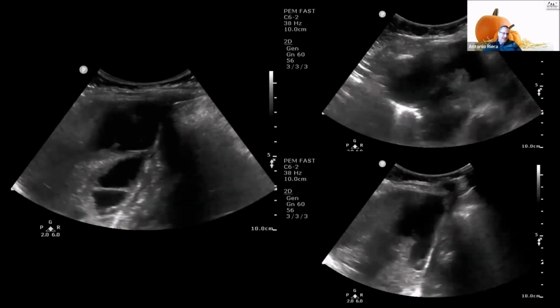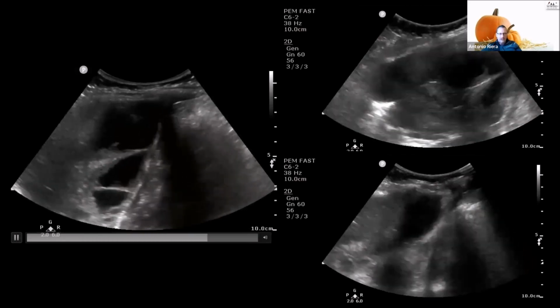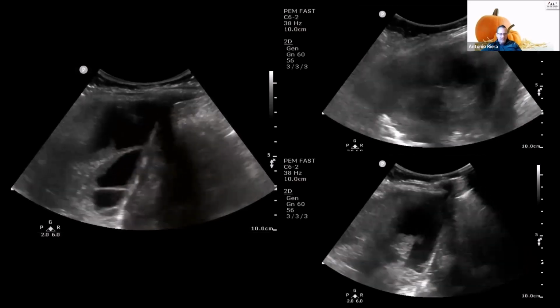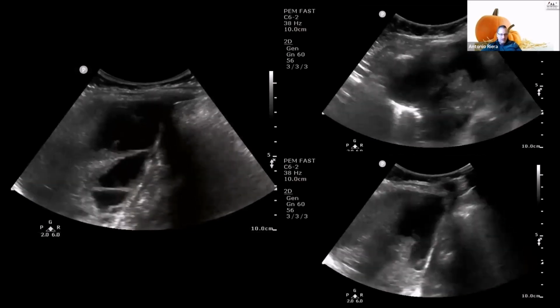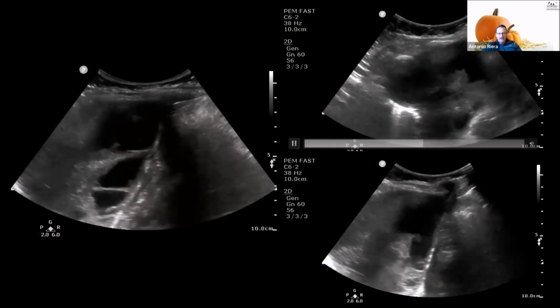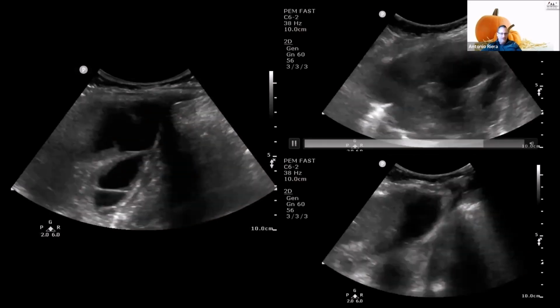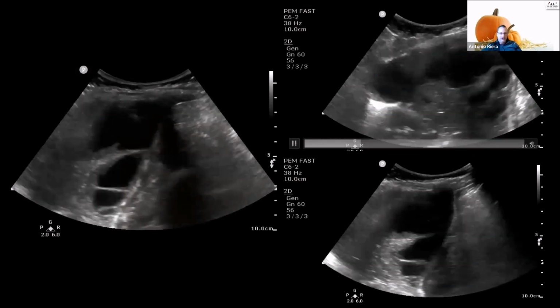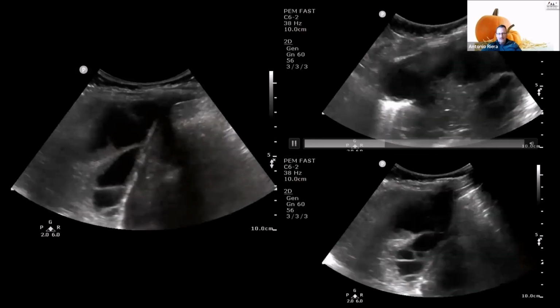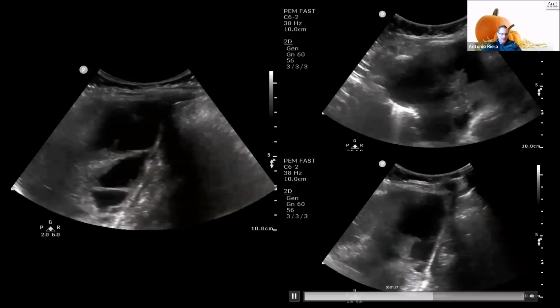And you can see a pretty complex sort of loculated fluid collection here, pneumonia going on over here. And so something like this probably deserves cross-sectional imaging. This is the transverse view again, which I love, posterior, big effusion, maybe some lung tissue here, that's okay. And then other findings suggestive of pneumonia over here.